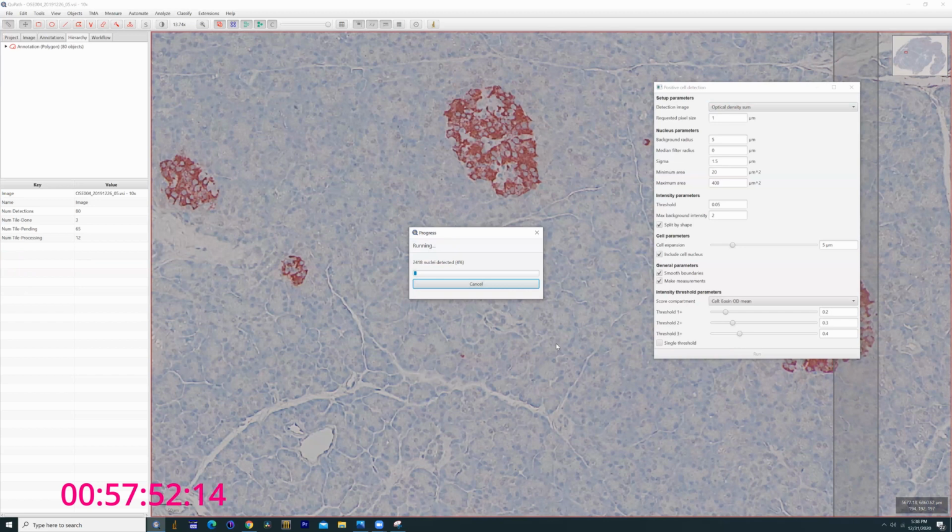So within the image, you have this hierarchy image in the annotation here. Annotation is 80 objects. This will actually map out to an Excel format that has a copy of all the data stored in this hierarchy. And you can, of course, export it, graph it. It's got a few basic graphic functions. You can actually map the different colors with the software.